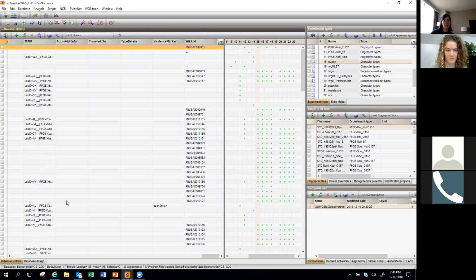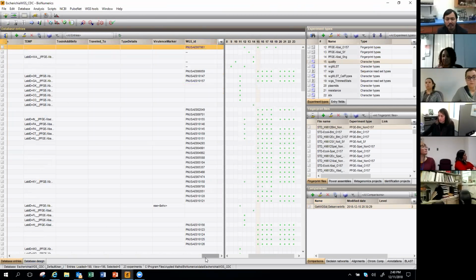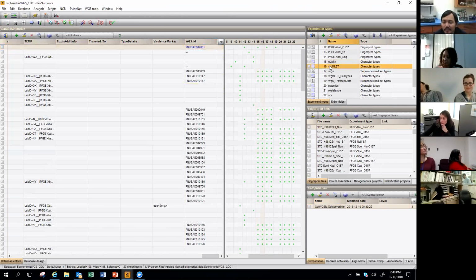So I'll try to quickly go over some of the analysis stuff. At this point, you've imported things into reference ID, you've speciated it, you've submitted it for allele calls and your genotyping results. Now you want to do the fun stuff, and that's the surveillance. One way to do it, there's many different ways of course, but anything that has a WGMLST experiment associated with it has sequence data.